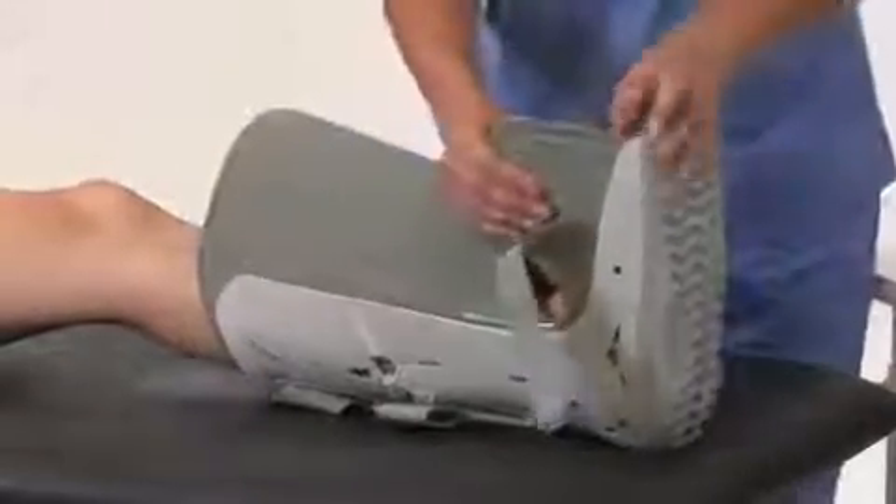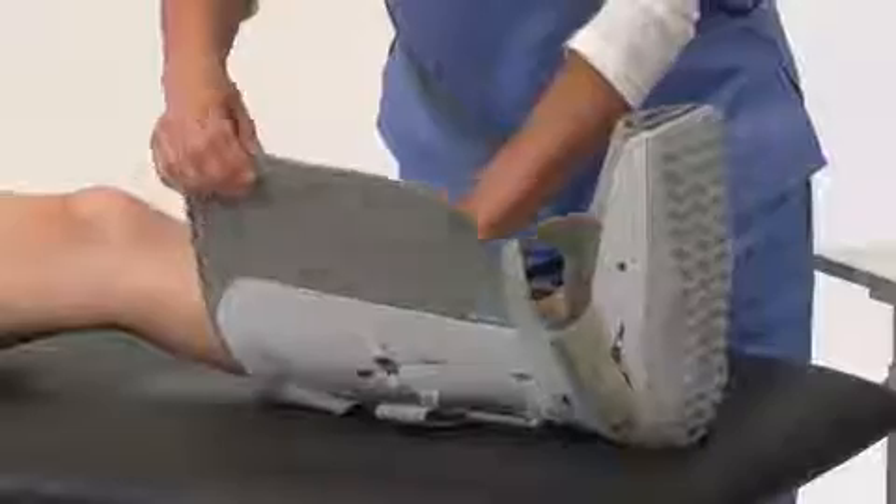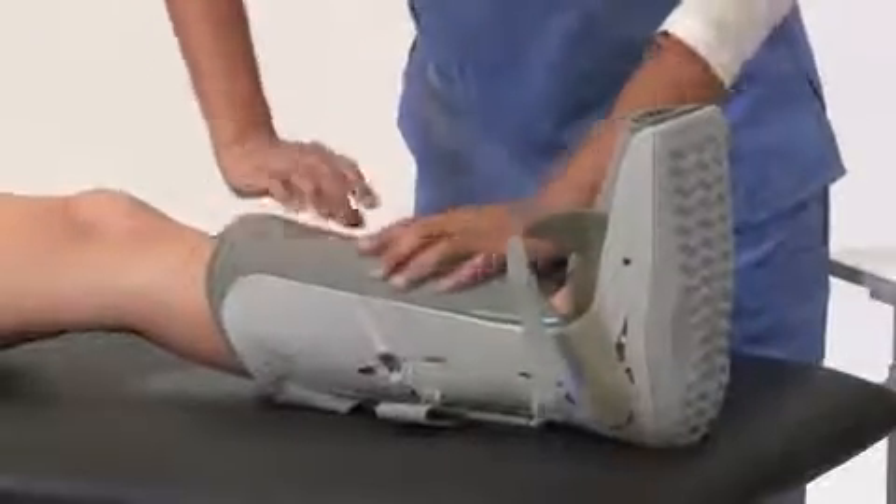Next, wrap the liner around your foot and leg. Smooth the wrinkles and secure.